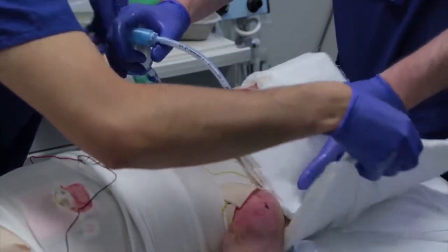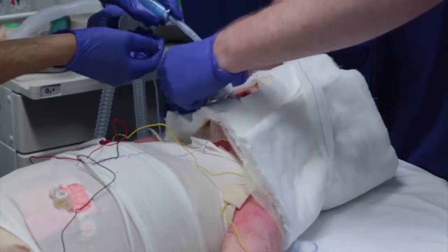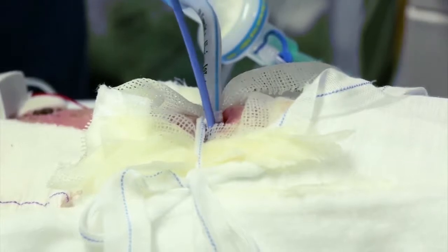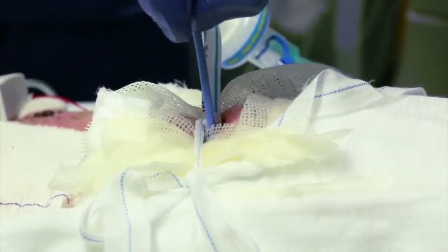Attention to detail is important. Here we ensure the tube tie doesn't rub on the angles of the mouth. An oral thermistor temperature monitor, as long as it is well greased, is safe and effective at measuring the patient's temperature intraoperatively.